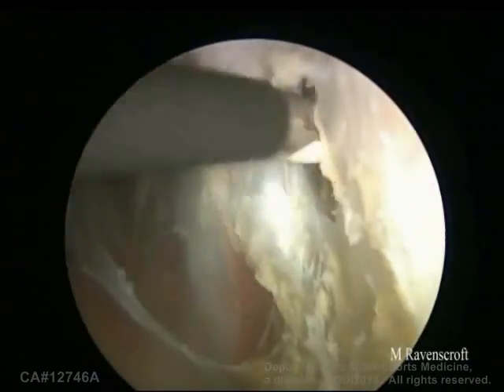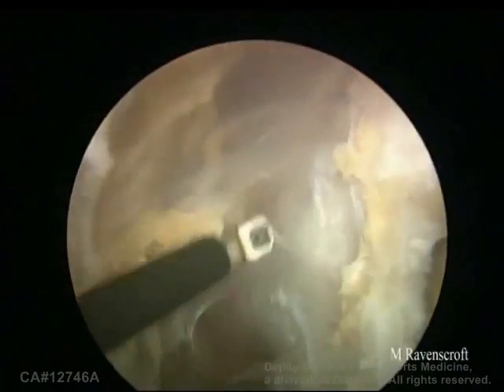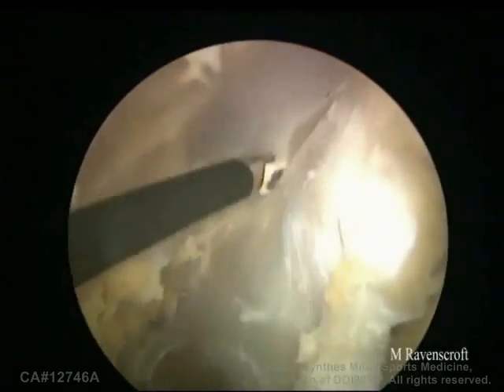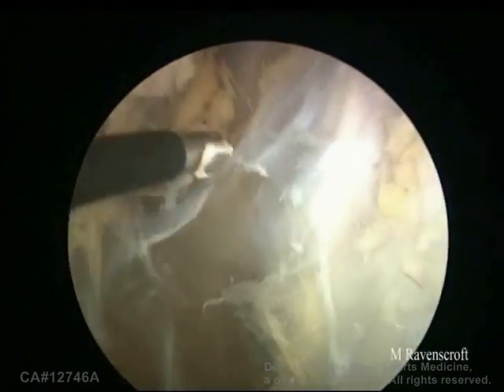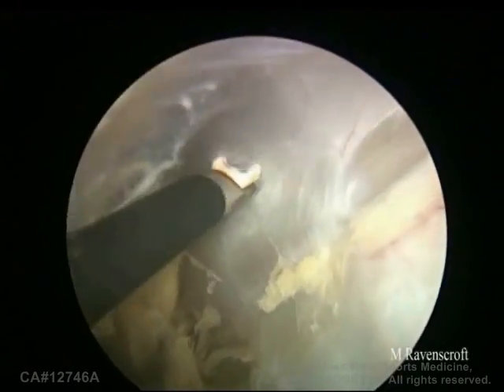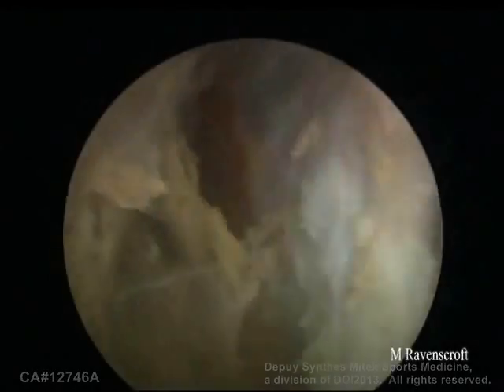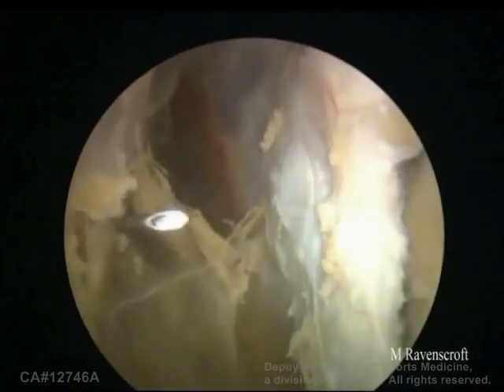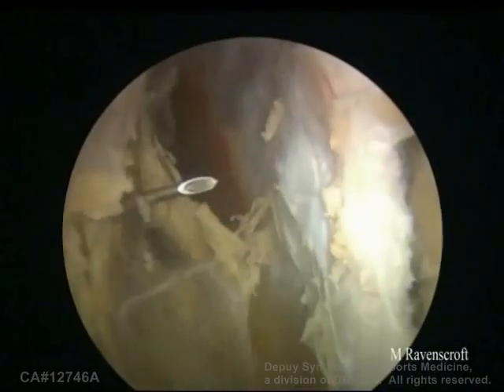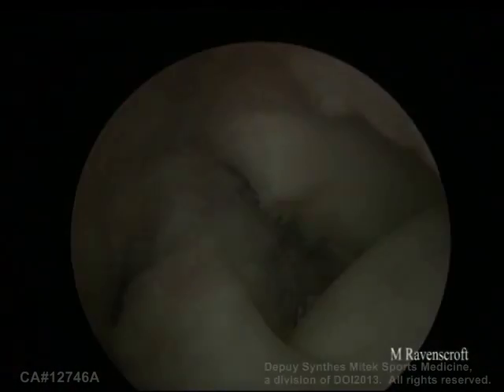You can just see the muscle belly of the pec major to the left at the bottom of the screen. So now working more medially, again clearing the coracoid and clearing the adventitial tissue in front of the conjoint tendon. If we go medially we'll start to see the muscle belly and tendon of pec minor. You can just see now the muscle belly of pec minor coming into the tendon into the coracoid process. Now we're going to make the M port. The spinal needle is through the M port and I'm imagining if I push this spinal needle through the conjoint tendon and through the subscap, that will be the right angle onto the glenoid.